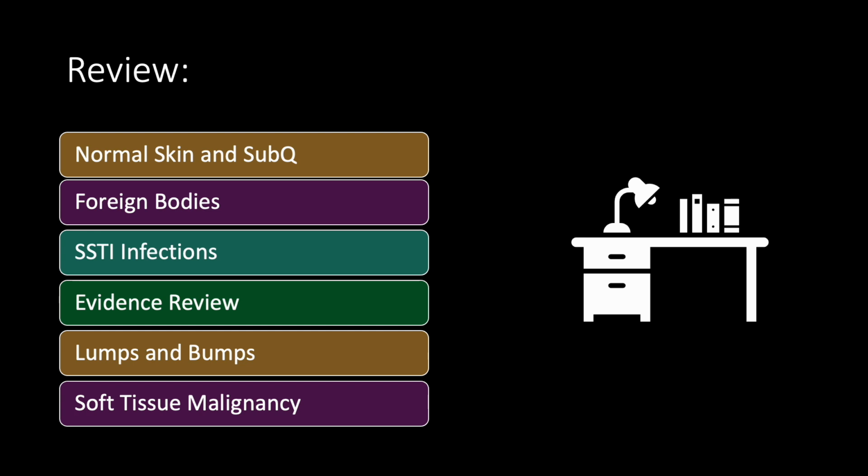So now that we've discussed the skin and subQ, let's dive a bit deeper into the muscles, tendons, and joints, and the ways ultrasound can help us diagnose musculoskeletal injuries in our next lesson.